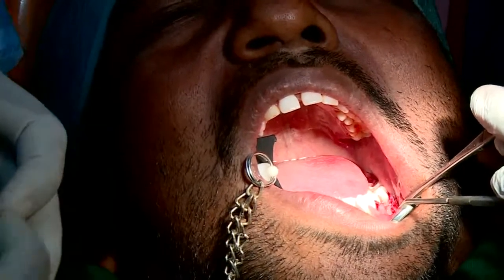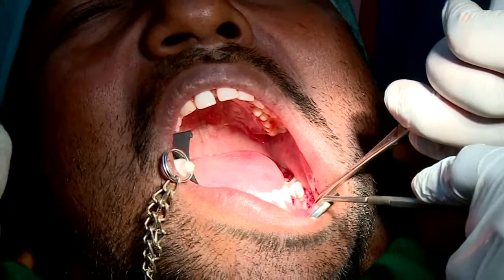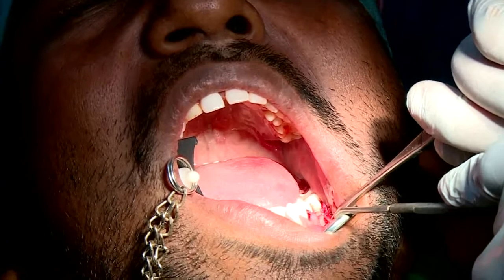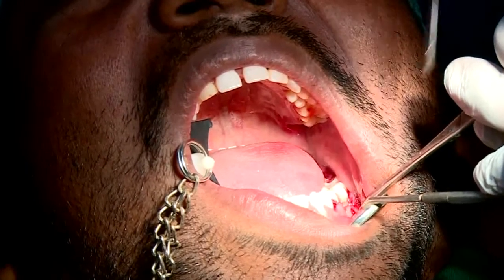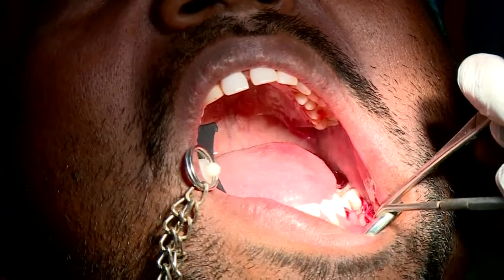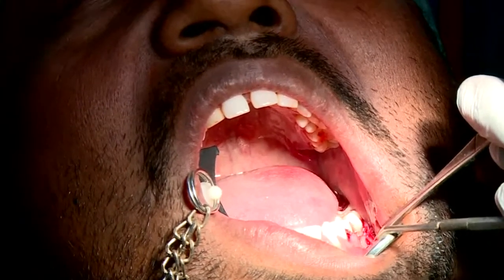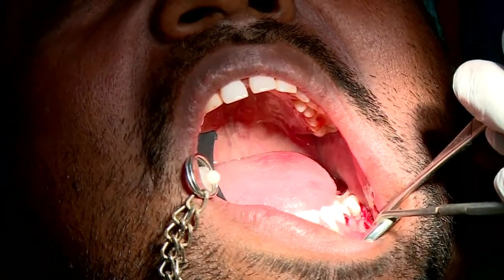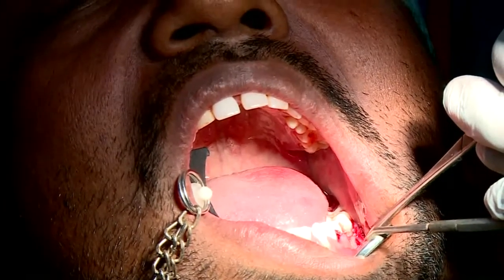If you go through the literature, it will show how much force you are putting in when placing the implant. If it just goes in by very simple finger pressure and it's still shaky, then the implant has very poor primary stability. These types of implants have a very good primary stability.